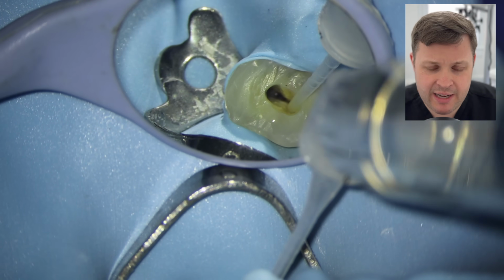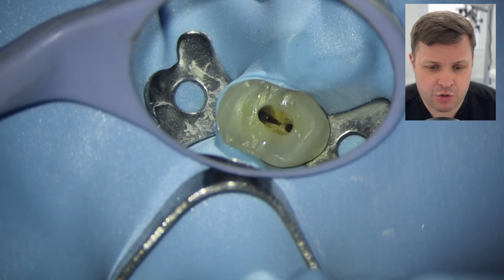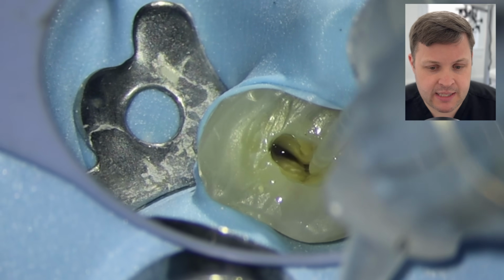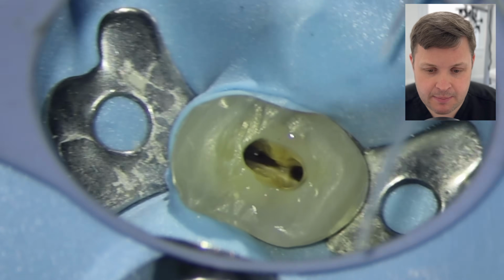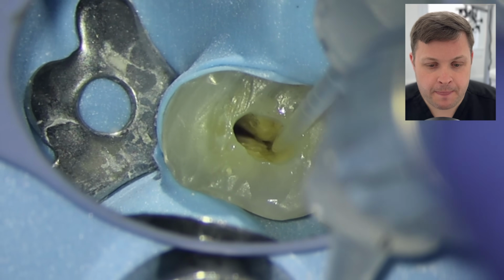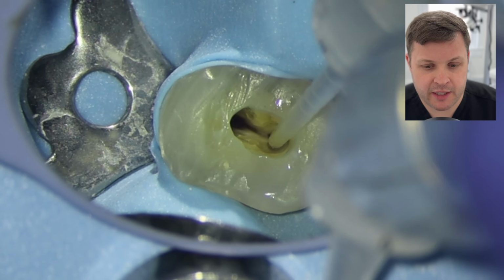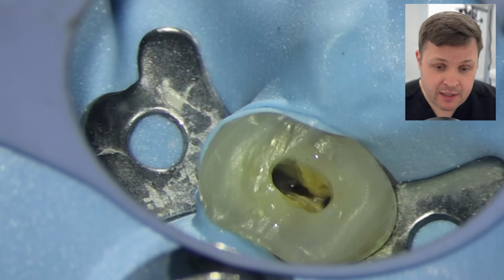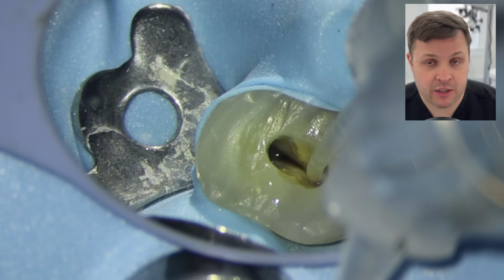But before we try to negotiate even further, I'm just going to work out if these two canals join, because I'm not too sure. I'm putting the Irriflex tip in one of the canal spaces and irrigating and aspirating. Although here it looks as if it's irrigating and aspirating at the same time, when we look really closely at the buccal, it's still full of irrigant. So I'm not too sure if they are separate or not, but we just need to keep that in mind. This could be where they just join apically, and the surface tension of the water just can't pass through yet until we've given it a good old clean out.